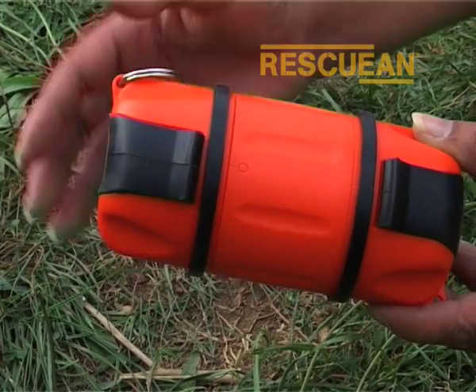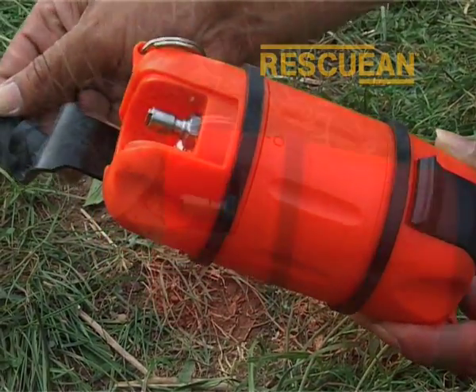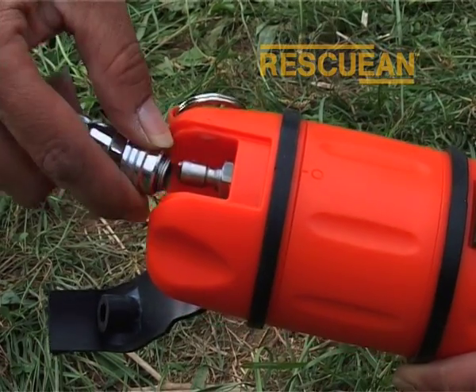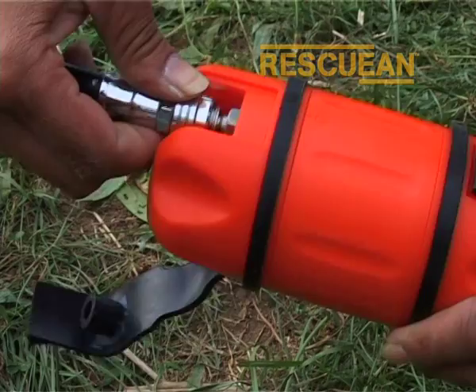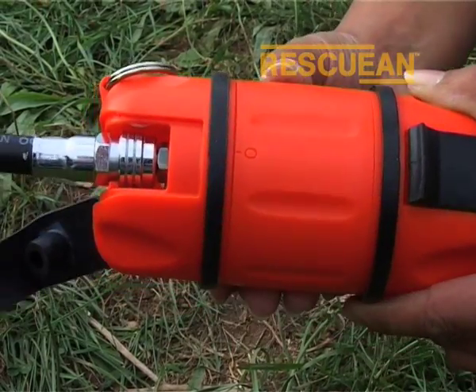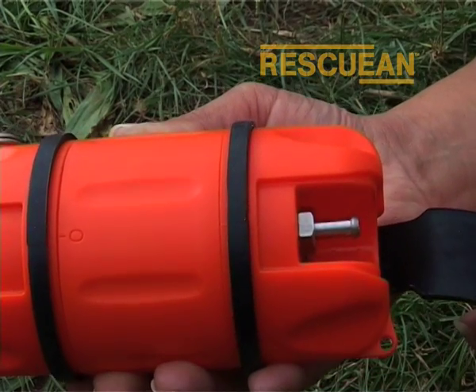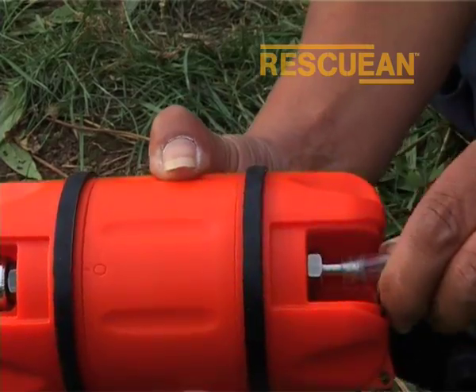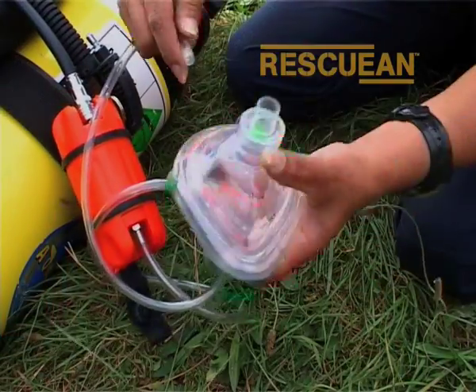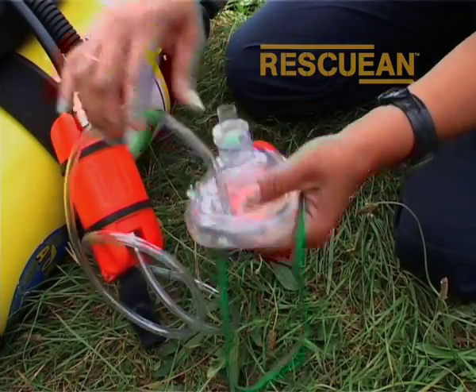The pod is simple, effective, and quick to set up in an emergency. Simply flip open the rubber cover from the top of the pod and connect the low pressure hose to the standard nipple. Move to the base of the unit and open the bottom rubber cover. Connect the tubing to the tapered outlet nozzle, then connect the other end of the tubing to the O2 inlet on the oro-nasal mask.